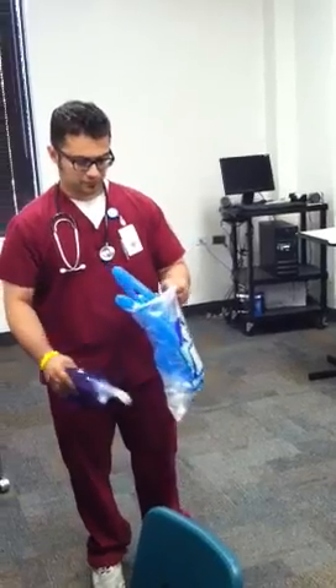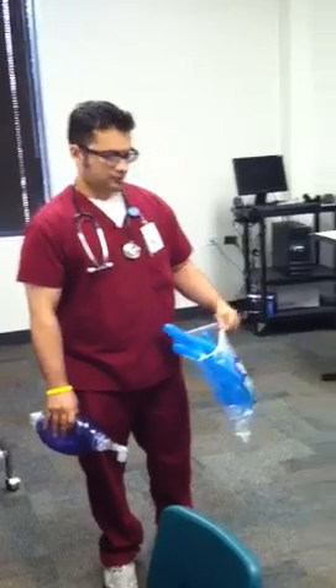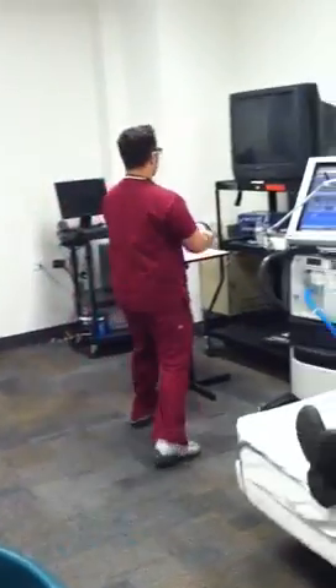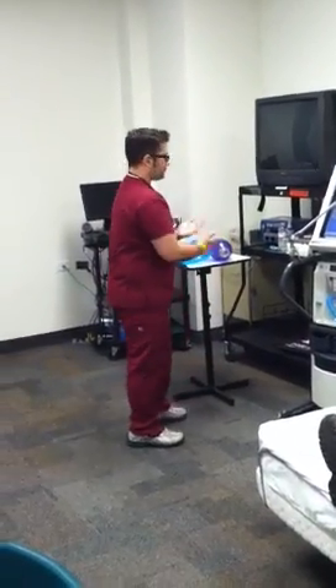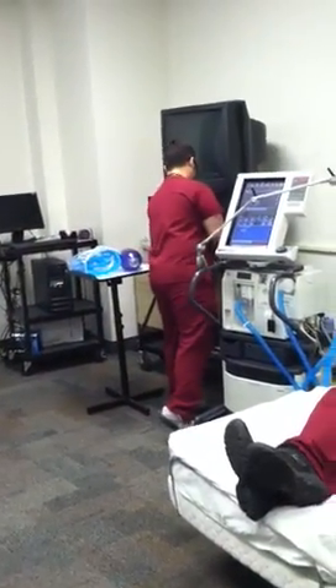First, Art gathers the equipment: obtains circuit humidifier, manual resuscitator bag, suction catheters, and a plastic bag for the used circuit. He maintains asepsis, washes hands, and observes universal precautions, utilizing gloves according to clinical facilities' policies and procedures.